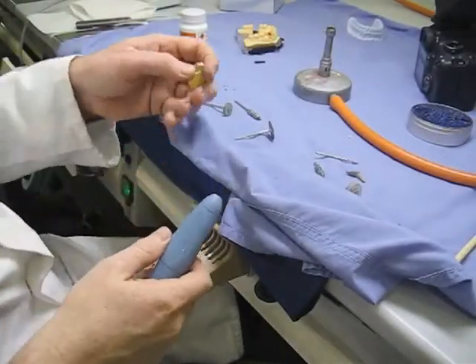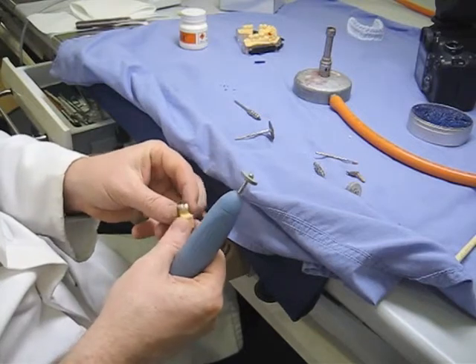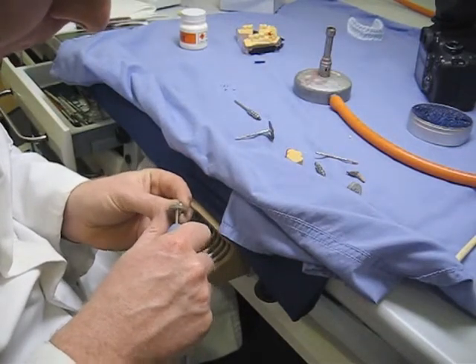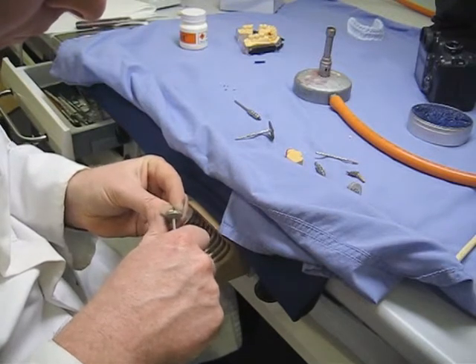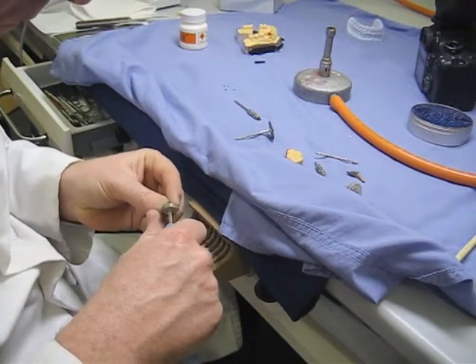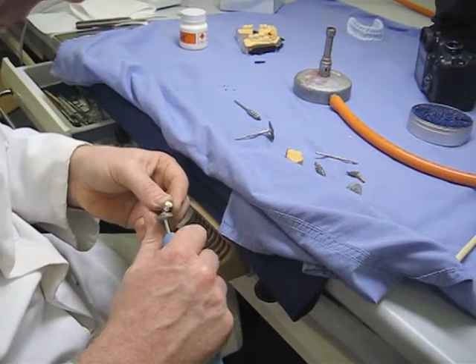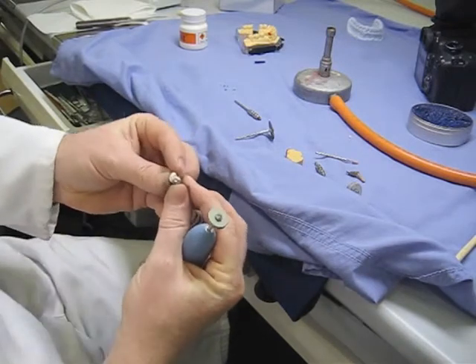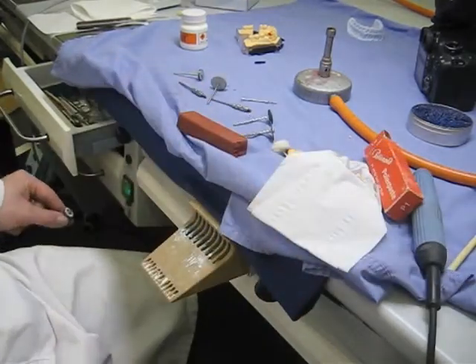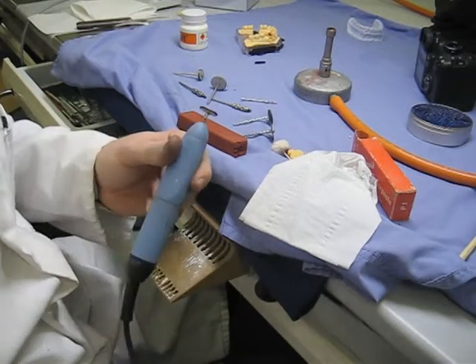Now we take a rubber wheel with very fine abrasive in it for the bulk of the polishing — similar to what you'd use on amalgam. The rubber wheel is very good at getting your crown very hot very fast, so you need to be careful. They are surprisingly abrasive, and if you have them set too fast — particularly on those fine margins where you've got a knife-edge finish — you can cause damage. You can see it's getting quite shiny now.